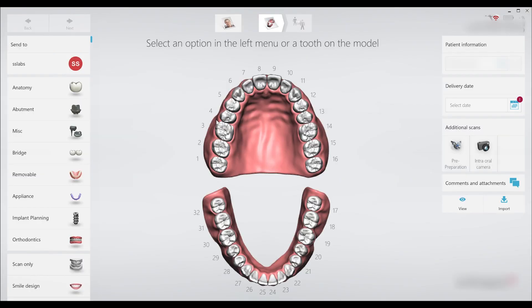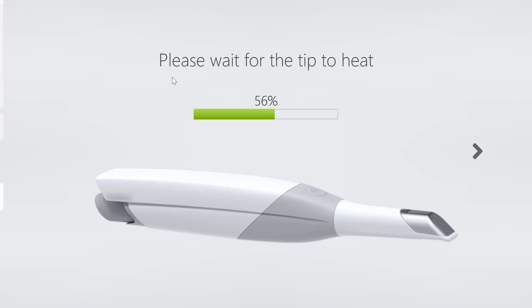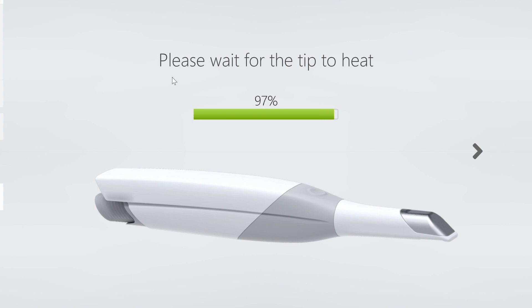After filling in the patient's information into your scanner system, wait for the scanner to defog before starting the scan. Most scanners will take a few seconds to heat the tip and prevent fogging of the lens when inserted into the patient's mouth.